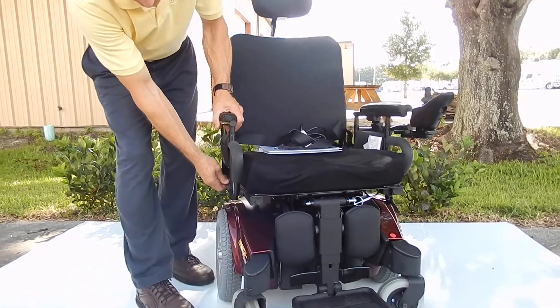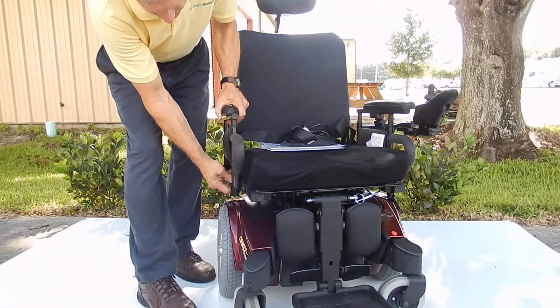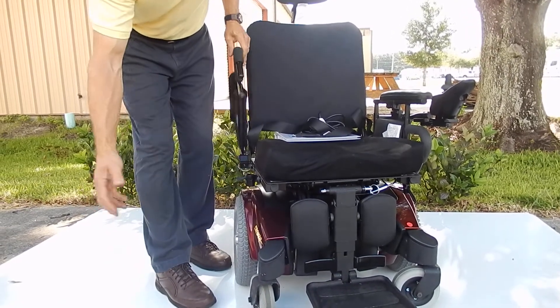The arms are adjustable. You just pull the lever and pull it out, and you can take the arm out of the way.